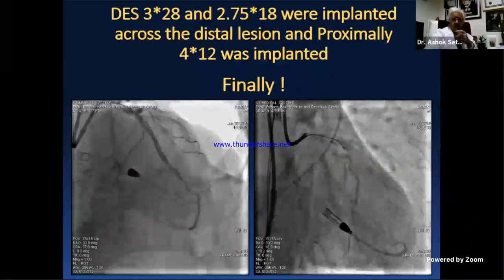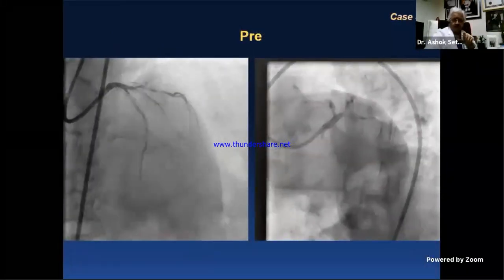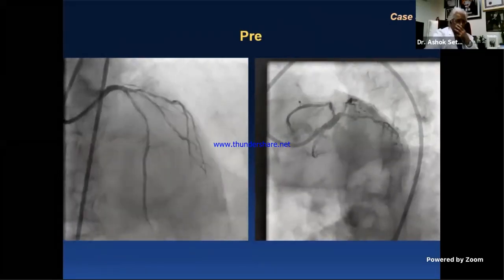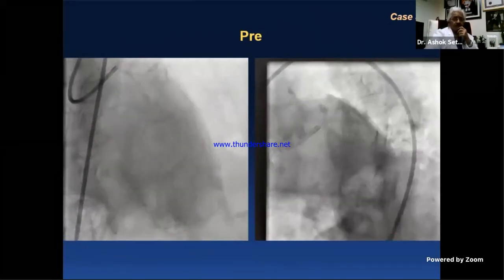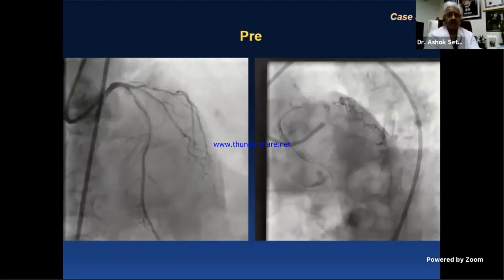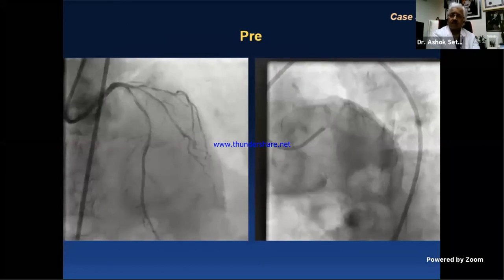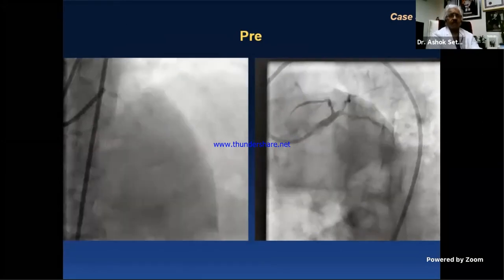can actually see. I was able to get that branch back, but this patient really, for the next 2 days, was terrible. It took him enough time because I had, by the way, stunned his myocardium, and the ejection fraction dropped from 30 to 20. Prolonged ischemic time is what happens when we deal with this.